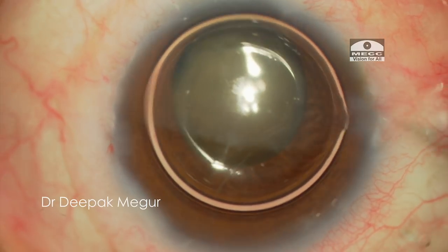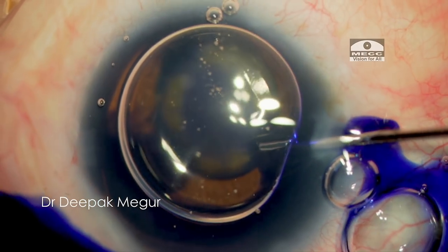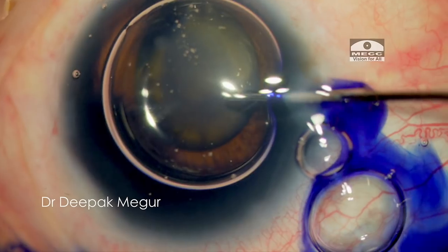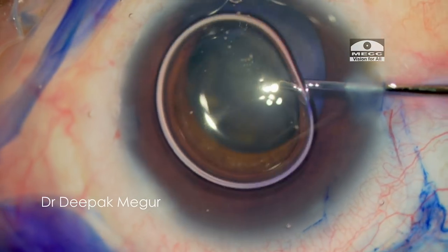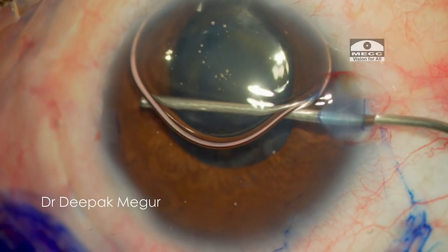The challenges I need to deal with are a very large and hard nucleus. Predominantly, the main issue is going to be the lack of space — there is no space for manipulation inside. I am basically dealing with a large nucleus in a small eye.